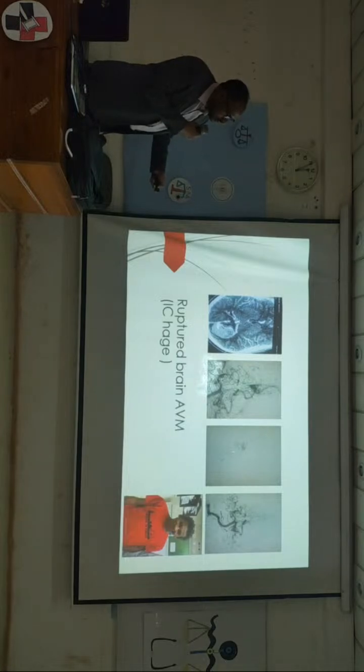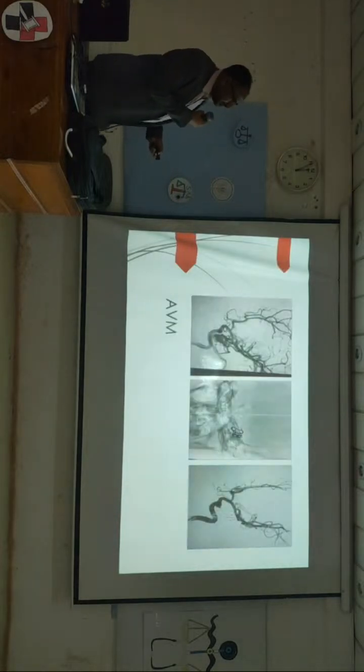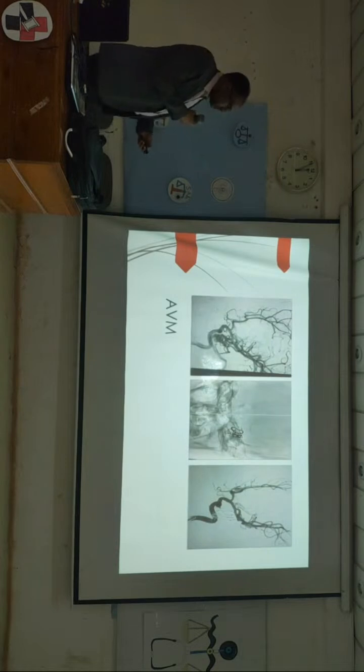And here, this is the last control. We see here this connection now closed after embolization, and this is a very nice smile from this young child. Another patient with ruptured arteriovenous malformation.